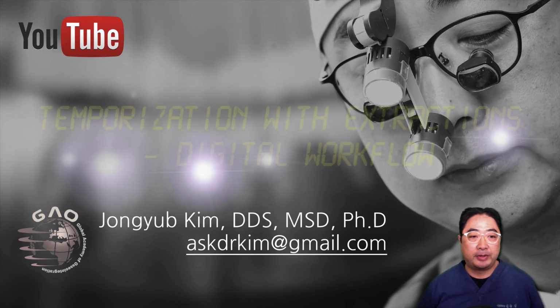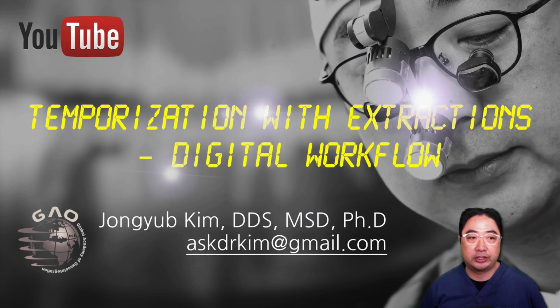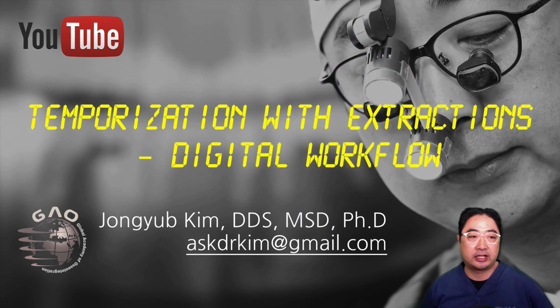Hello everybody, I'm back, and today I'm going to share a clinical case of digital dentistry. Let's get in.